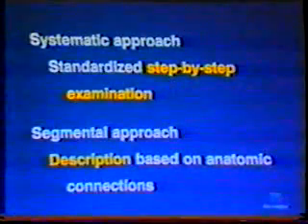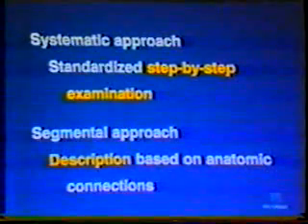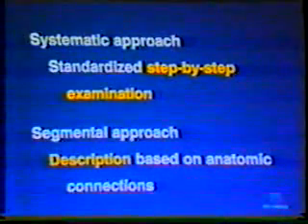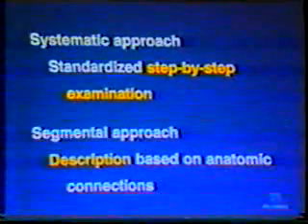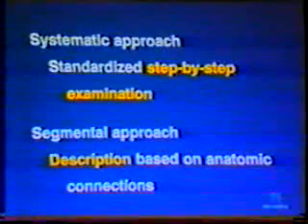For evaluation of cyanotic and complex congenital heart defects, a systematic as well as segmental approach is required. Every examination should be performed in a methodical manner with complete understanding of transducer and image orientation. We recommend that 4-chamber views should be oriented with apex down, which displays the image in a familiar anatomic format. The first step in examination is to establish the cardiac position in the chest.